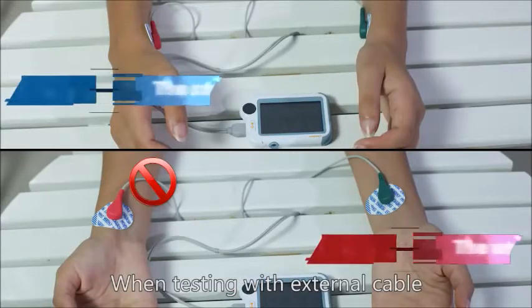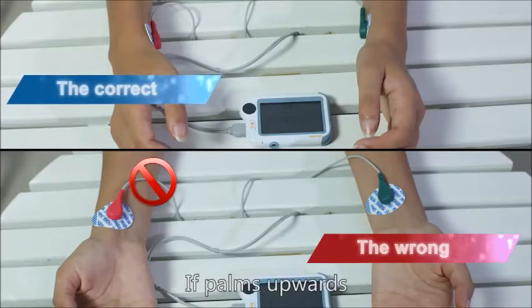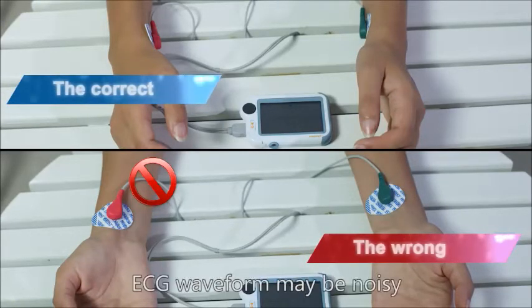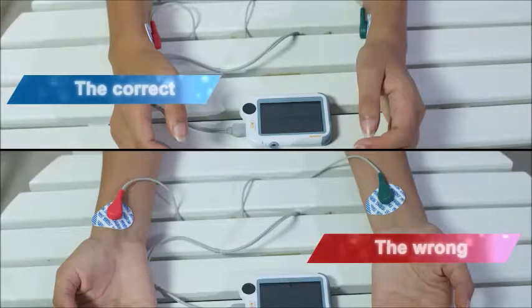When testing with an external cable, keep your arms relaxed. Let your palms face each other. If your palms are upwards, the ECG waveform may be noisy as the muscle of your arm is under stress.